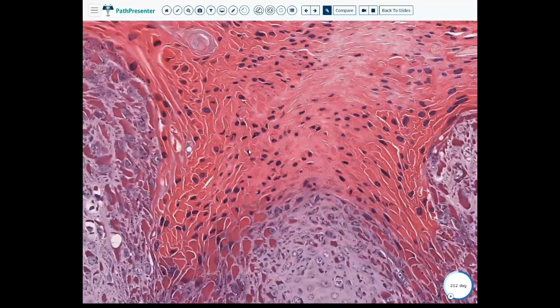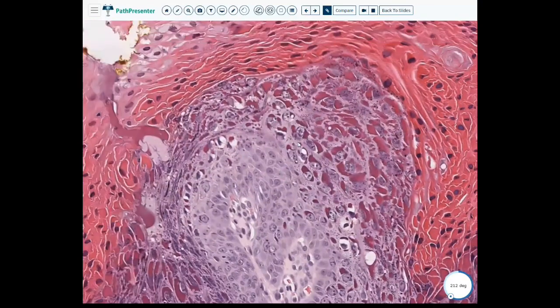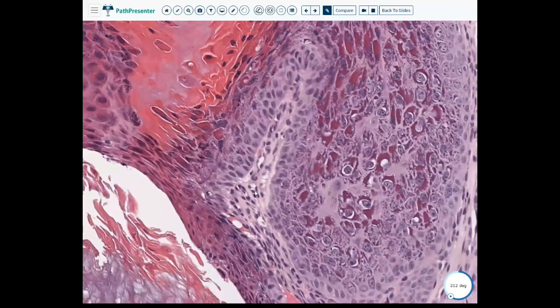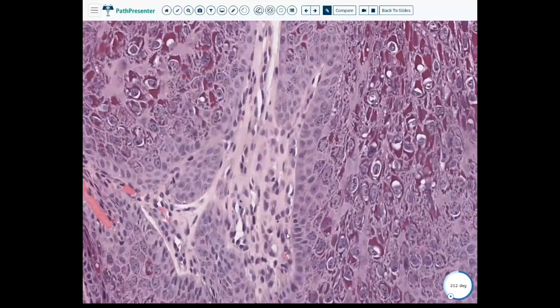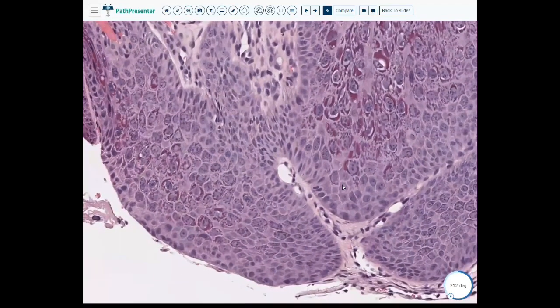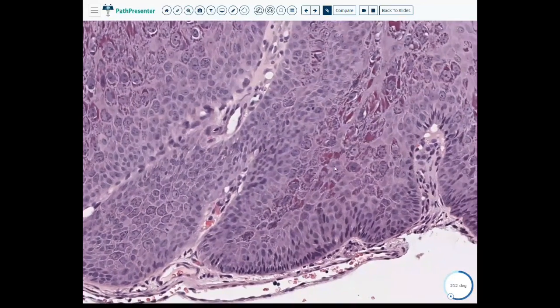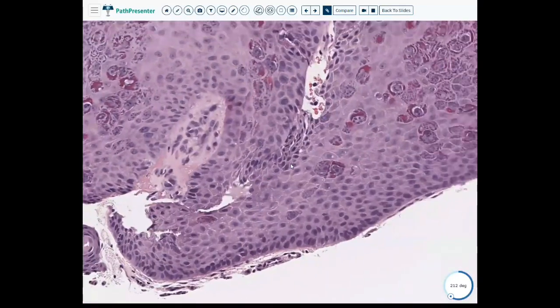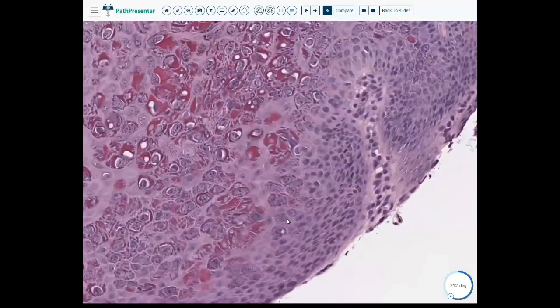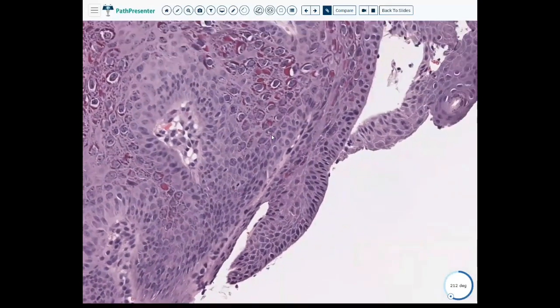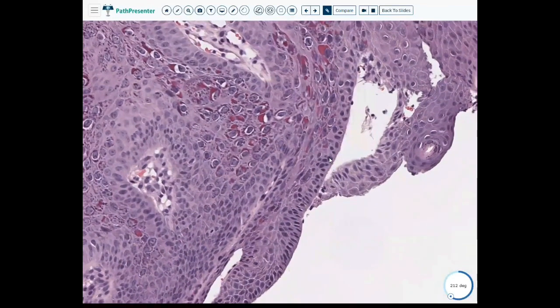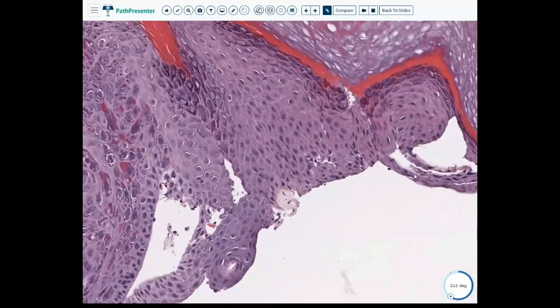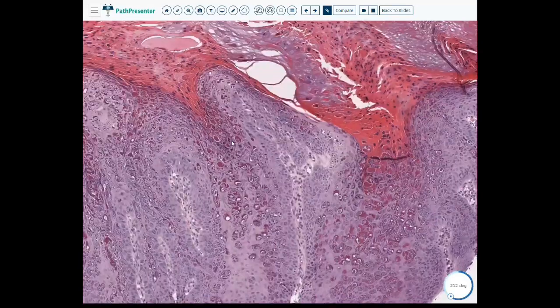Those basophilic granules. Mitotic activity should still be at the basilar layer. It's just because you have this undulating or papillary pattern that makes it somewhat difficult to tell what you're looking at. Maybe there's one here. This is definitely a verruca — this is Verruca vulgaris. If you want a nice example of the intracorneal hemorrhage, the case we talked about in the lecture is really nice.